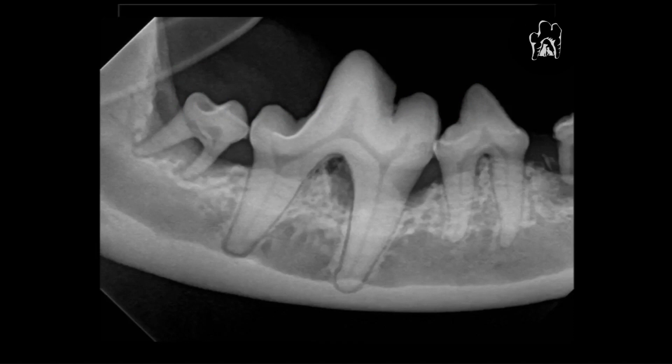Looking at this radiograph, if you look at that last molar on the far left, that one has no bone surrounding those roots. That is definitely an extraction. That's not a particularly critical tooth by any means, so extracting that is definitely in the best interest of this patient.